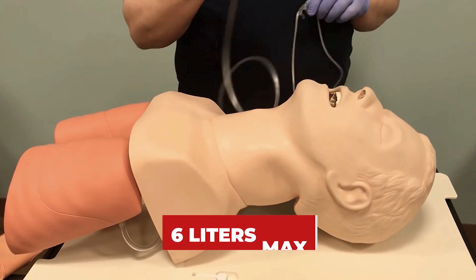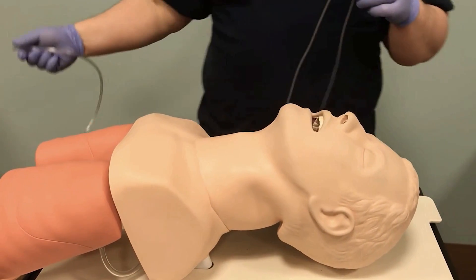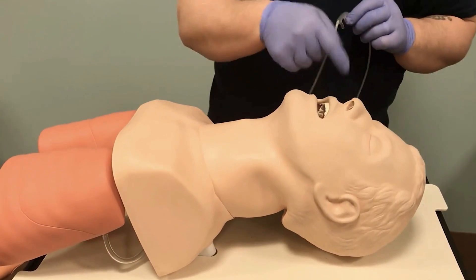When we go to apply this device, this end attaches to our oxygen tank. It would be plugged into the oxygen tank, and this is where the oxygen would be delivered.